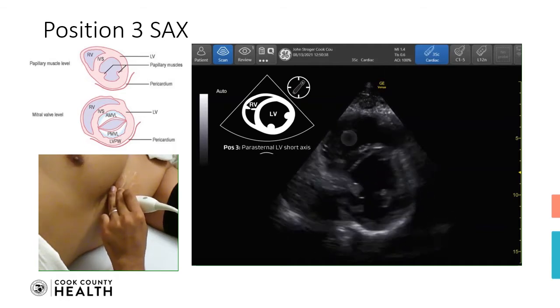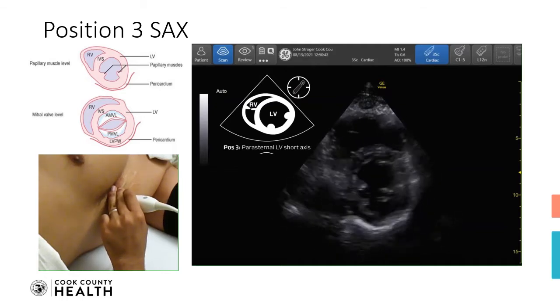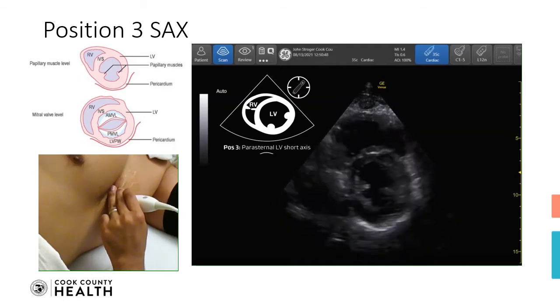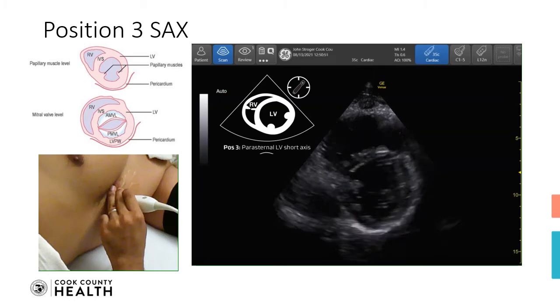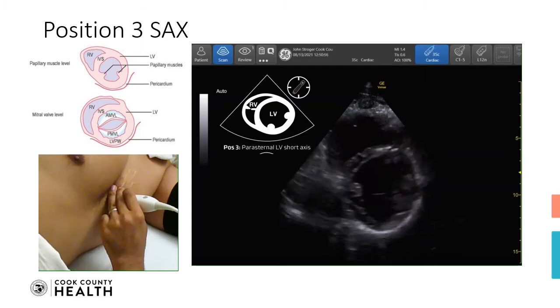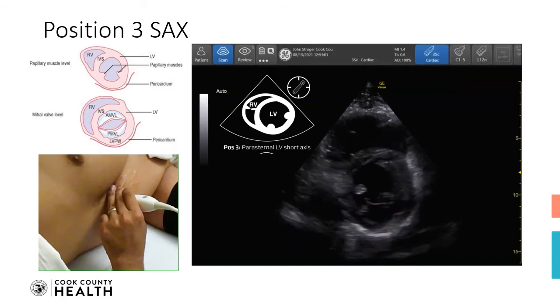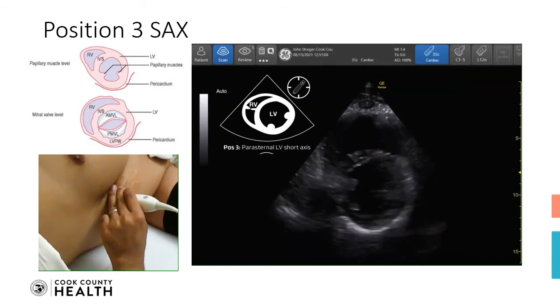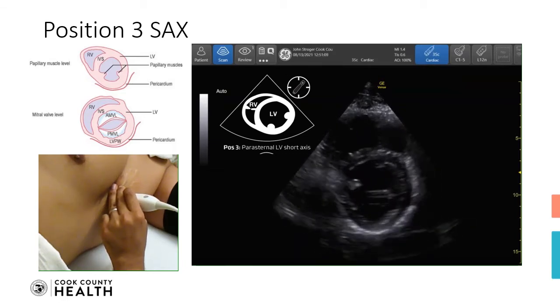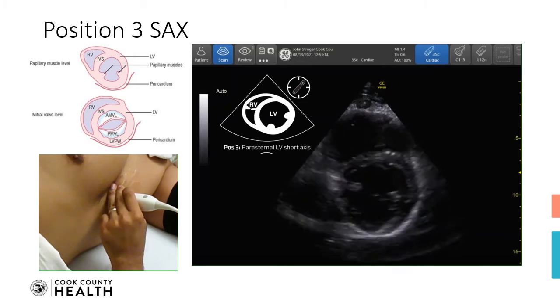And as you can see, we are comparing here the size of the right ventricle with the left ventricle. And in cases of right ventricular overload, the septum, which appears well rounded here, will appear flat. It can be flattened in diastole or in systole. If there is both diastolic and systolic flattening, giving a D-shaped left ventricle, then that is going to be suggestive of volume and pressure overload of the right ventricle.